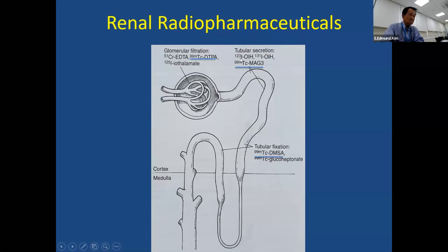Iodine 123 is cyclotron produced. Iodine 131 has a very high energy and also emits beta rays, so we cannot inject more than 1 millicurie, and we cannot generate dynamic sequential images.